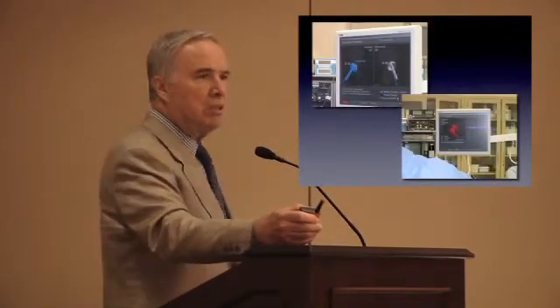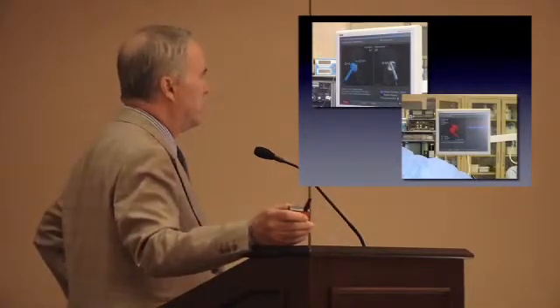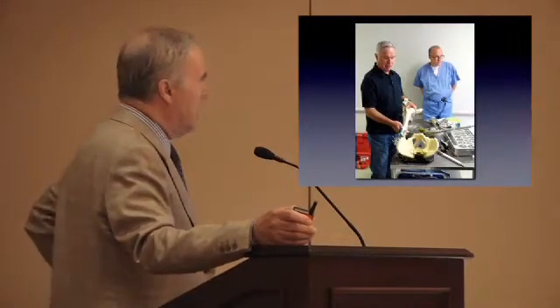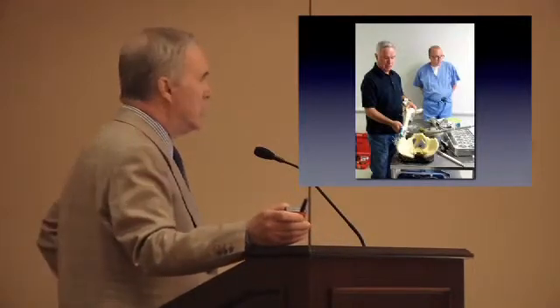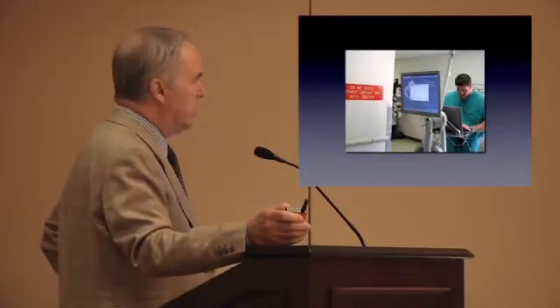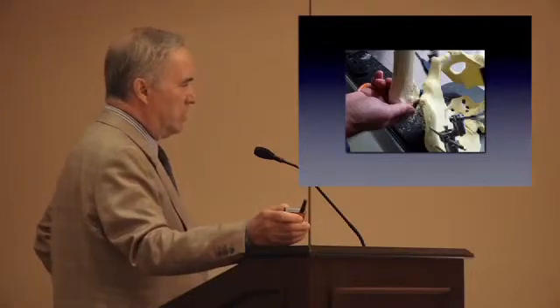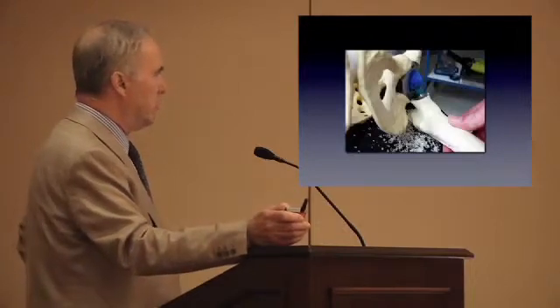Navigation may have a role, and you certainly do increase your accuracy with the use of navigation. We looked at the issue with respect to impingement, doing just a simple, quick and dirty sawbone study with the aid of navigation to look at various combinations of head diameters, neck lengths, and different style acetabular components, using navigation to look at our range of motion. And when we encountered impingement, here's impingement in flexion and adduction, and posterior impingement with full extension and external rotation.